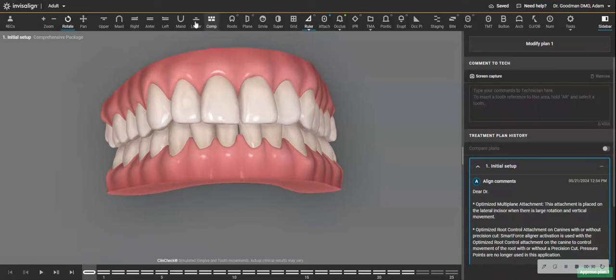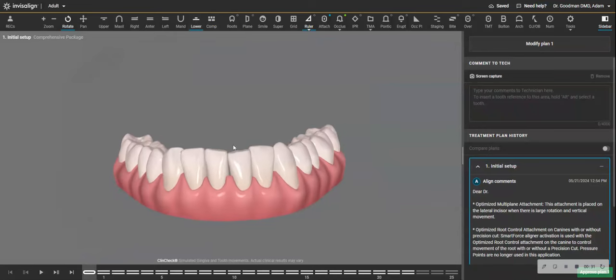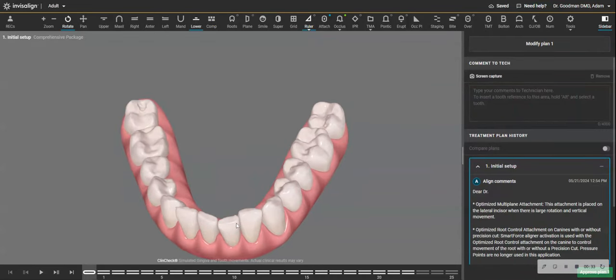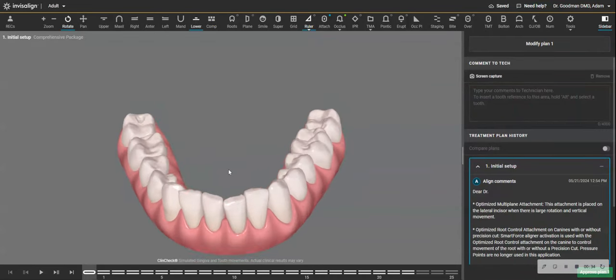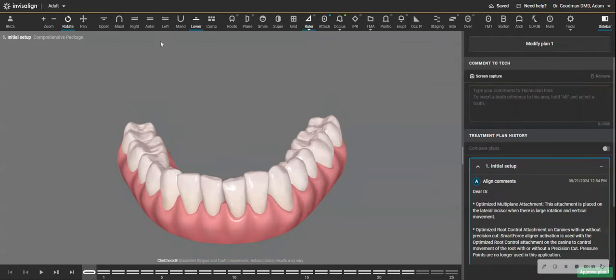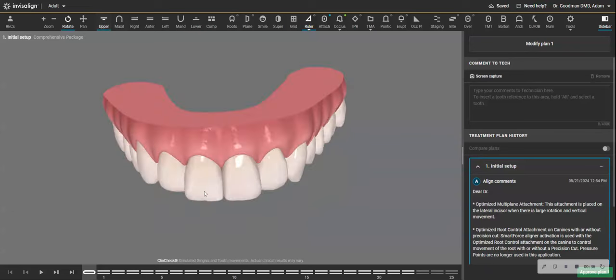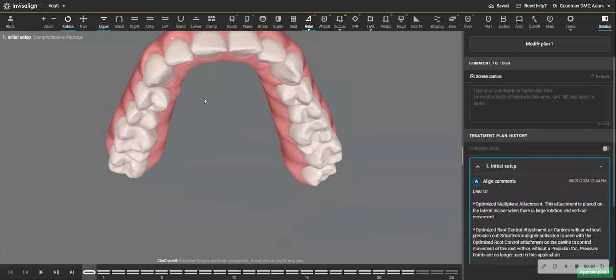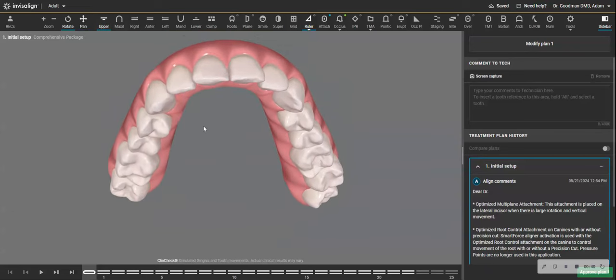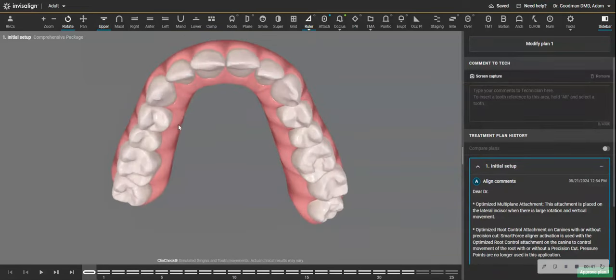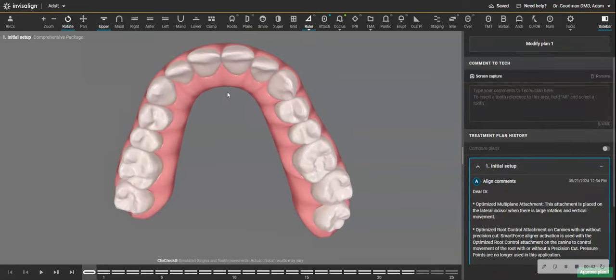The problem is that there is some wear on the lower front teeth and some crowding that has gotten worse over time. Here you see the upper crowding.